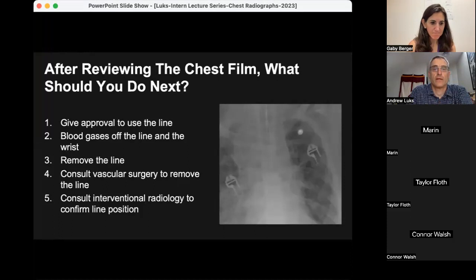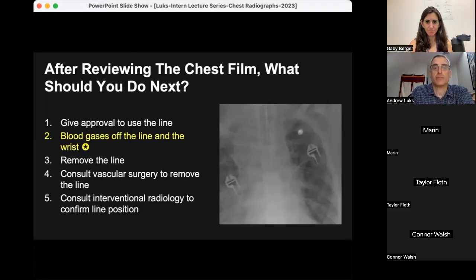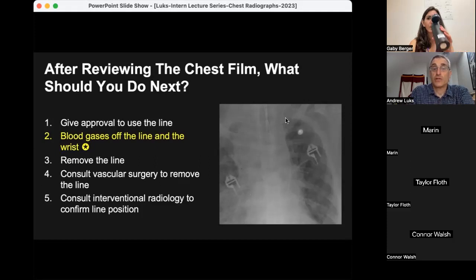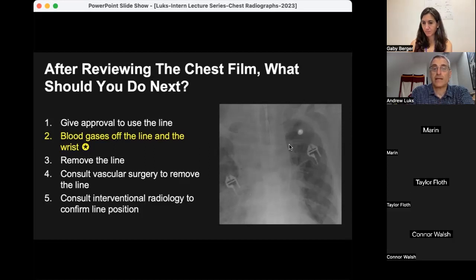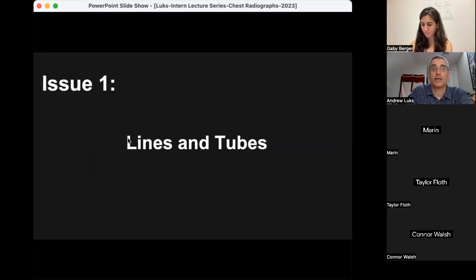A lot of people wanted to remove the line, but it's worthwhile to have some concern. The appropriate answer is to first obtain simultaneous blood gases off the line and the wrist to confirm placement. Generally a central venous catheter should end in the superior vena cava, which is usually on the patient's right side. In this case it ends on the left side, raising concern it may be in the aorta — but this patient has a persistent left superior vena cava, sometimes seen with Down syndrome. The catheter is actually in an okay position, confirmed by comparing the blood gases simultaneously.